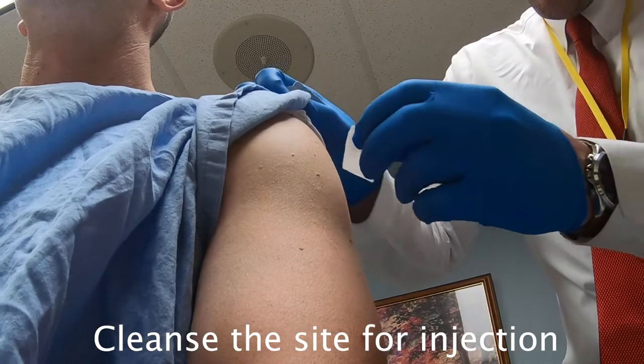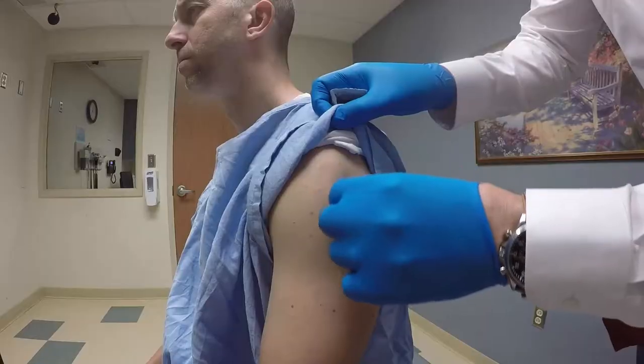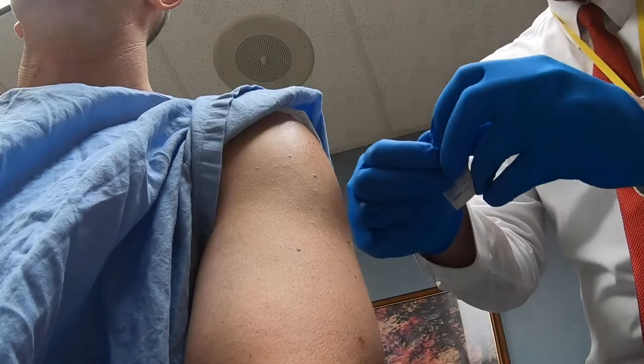Using an alcohol swab, we're going to swab in a circular motion starting from the middle outwards. Repeat it with a second swab.